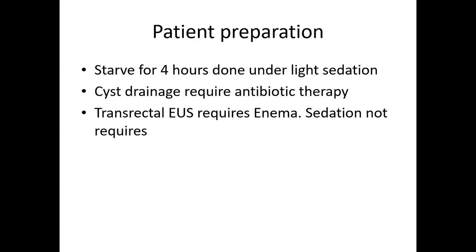If you are doing the transrectal endoscopic ultrasound, we usually give the patients an enema, which will give them diarrhea, so that the lumen of the colon is clear, so that we can visualize it and it doesn't give us disturbances in terms of the images that we are going to get. Sedation usually is not required for these patients because the probe is quite small in diameter.